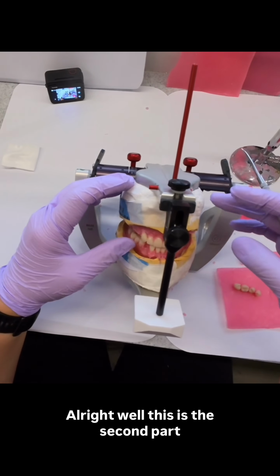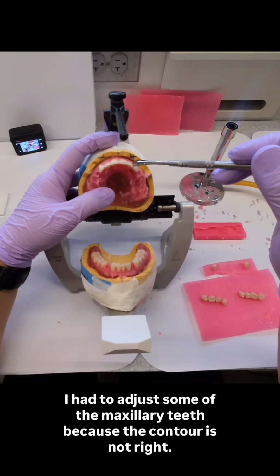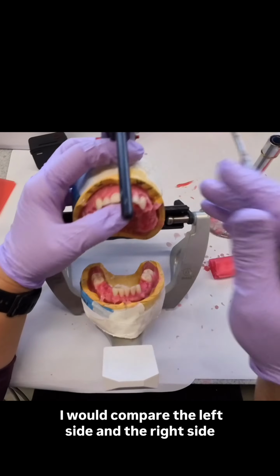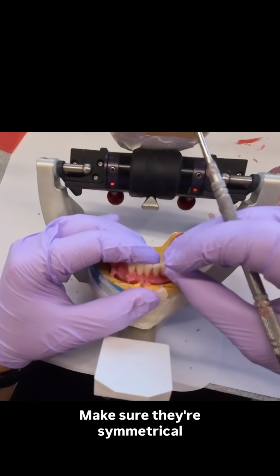All right. Well, this is the second part. I had to adjust some of the maxillary teeth because the contour is not right. Like I would compare the left side and the right side to make sure they're symmetrical.